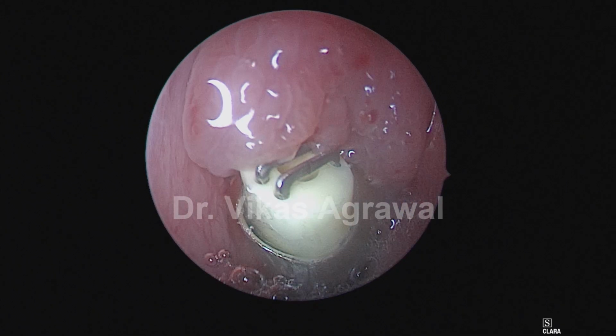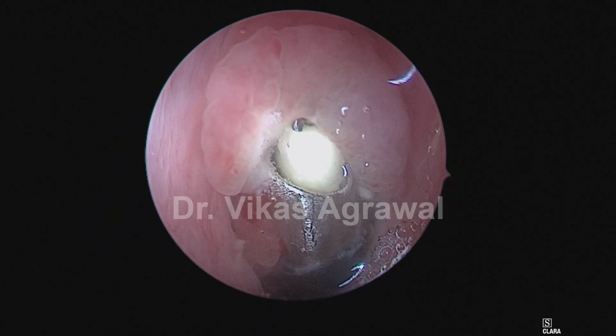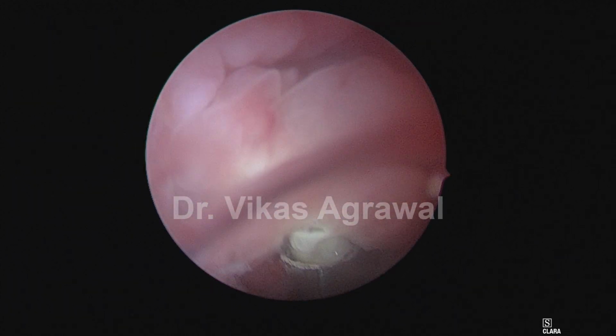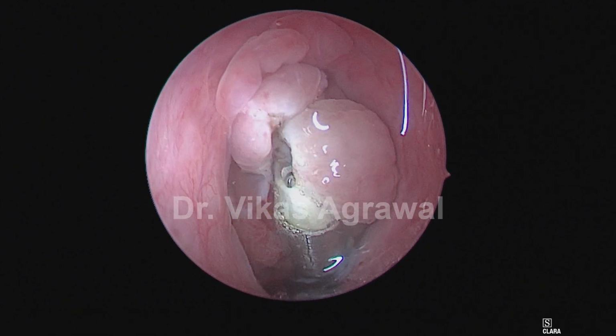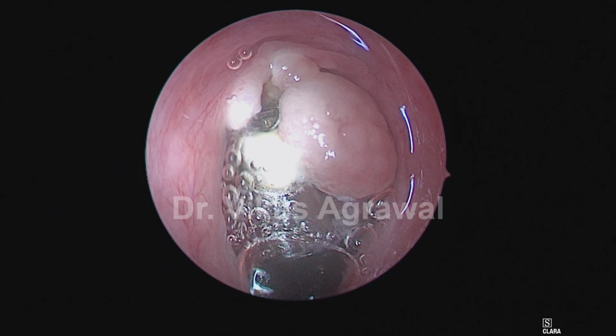Okay, thank you. And I'll just debulk some of the adenoids so that I can get space to move the wand. Right now I have no space to move my wand, but in a moment I'll create some space.